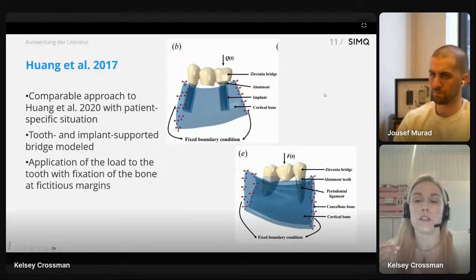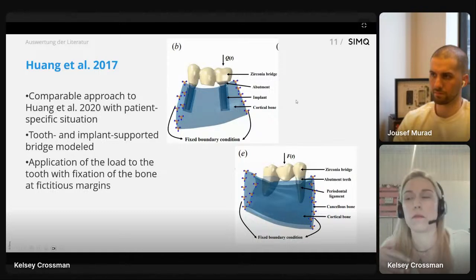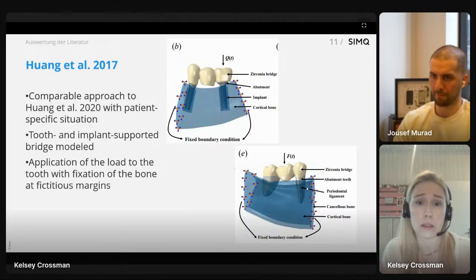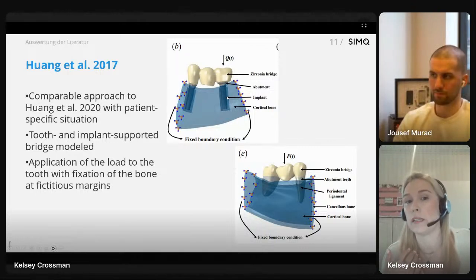And the difference is you can't just use the same calculation and say, okay, the bridge will behave this way for metal or for tooth, because the tooth has periodontal ligaments, and each tooth moves a little bit as natural bone does because it's a living organ. So then we know that the force is dispersed differently and deforms differently when the implant is metal.